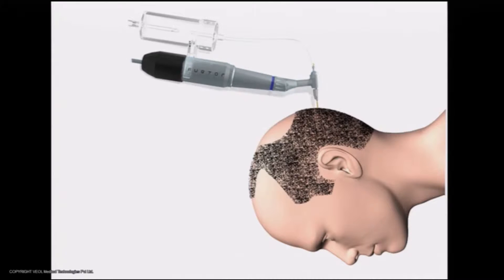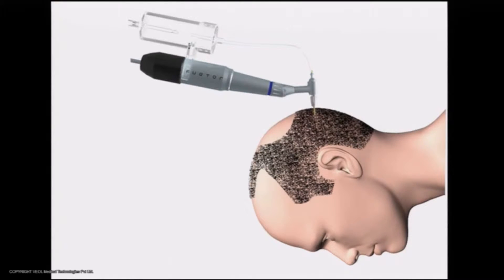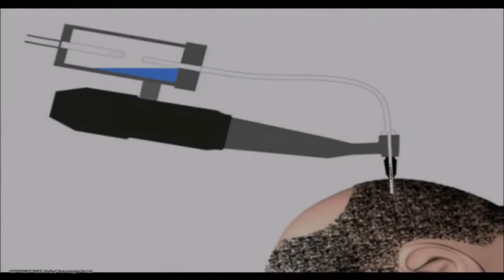The harvester can be controlled by using the wireless foot pedal. Pressing the pedal starts the suction and rotation of the punch. The surgeon can then score the follicles out, and the suction force pulls them along with blood and stores them in the canister.